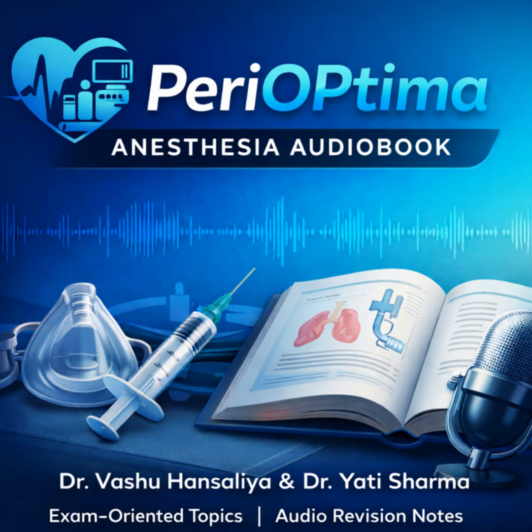You must know them. So if fresh gas doesn't flow through the sump, how is the agent actually delivered to the patient? The Tech 6 Plus is a dual-circuit system. The clinician dials the desired concentration, say 6%. The machine's electronics then sense the total fresh gas flow rate entering the vaporizer. Right. It uses that data to precisely inject the required amount of pure, high-pressure Desflurane vapor from that 2-atmosphere sump directly into the fresh gas stream just before it exits the vaporizer. So it's incredibly accurate. Highly accurate, and it compensates for changes in fresh gas flow and ambient temperature.